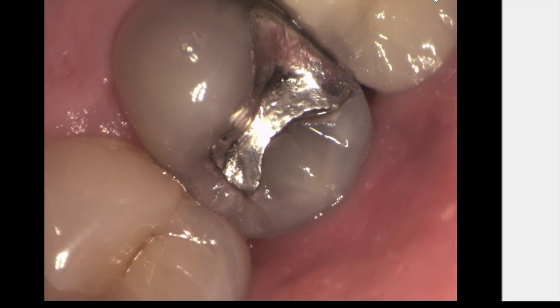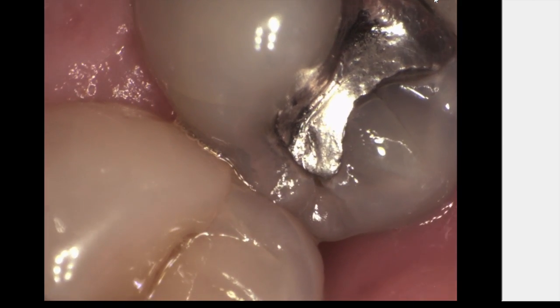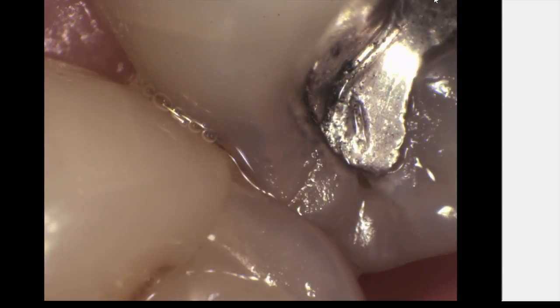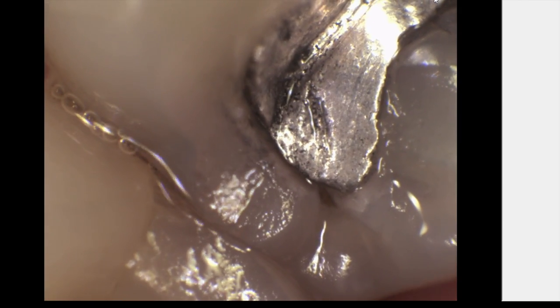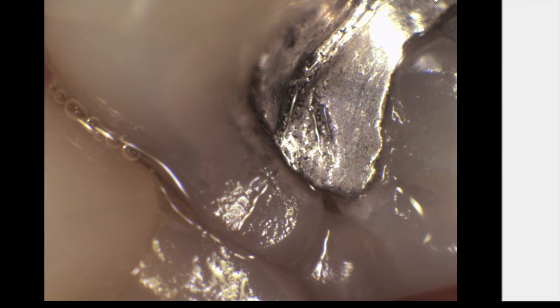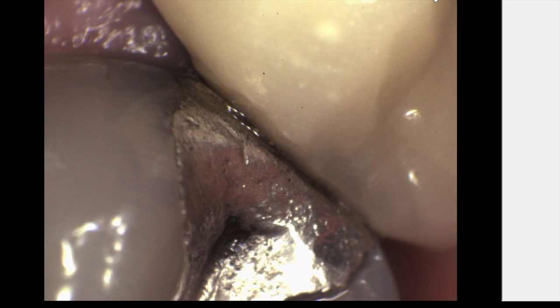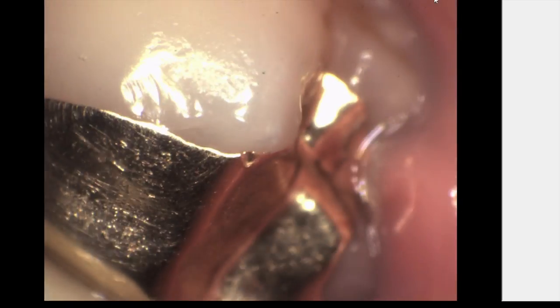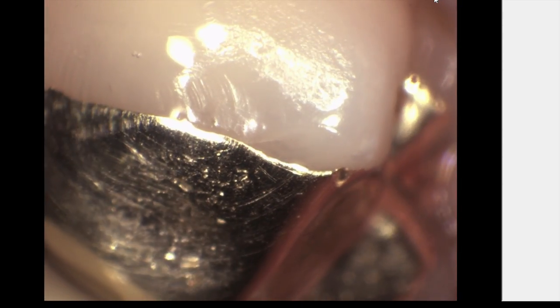These next images are all intraoral and I want to point out that they all have the camera cover or the protective barrier sheath installed on the camera. Note how there is no degradation in the image when using a camera cover. This allows you to use one freely, being your choice.